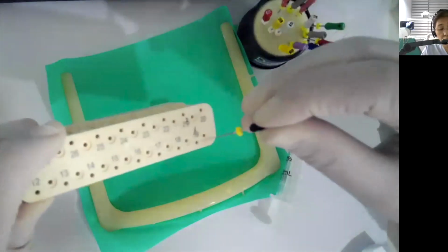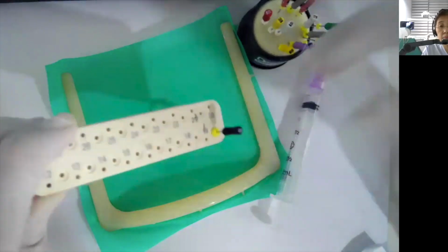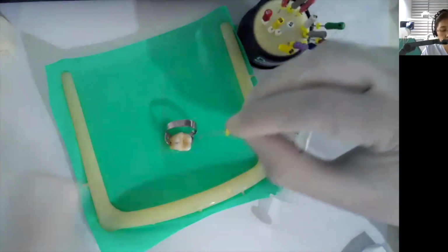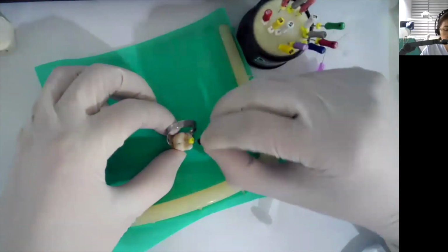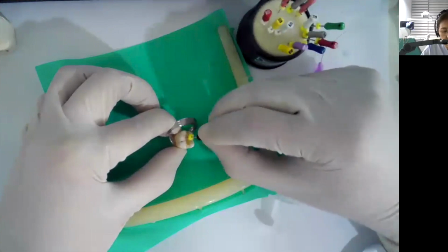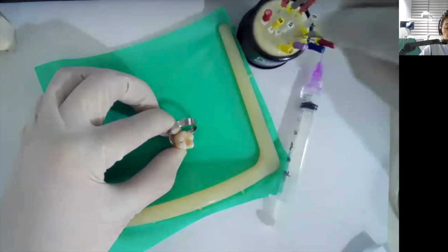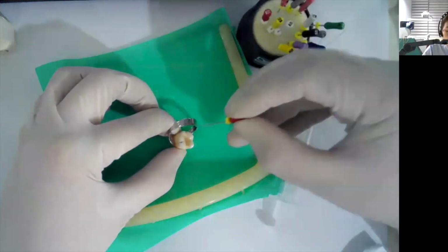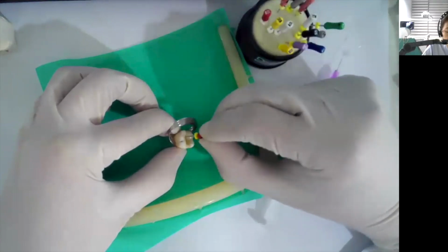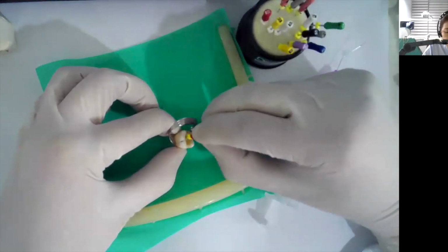This is measured at 19.5. Okay, put some EDTA. Okay, it's reaching the reference point. Then I'll go back to the last file at 22.5 to my working length. See, it can easily be inserted, and I'm having the apical stop.